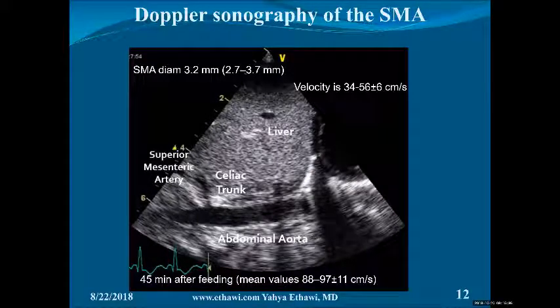So I'll put the marker up, then I'll tilt it to the left side of the patient. You will put your probe in the middle, through sagittal, with your marker pointed up. And then you tilt your transducer a little bit to the right, pointing a little bit to the left of the patient. You look to the left, like this. So you see a hollow organ.